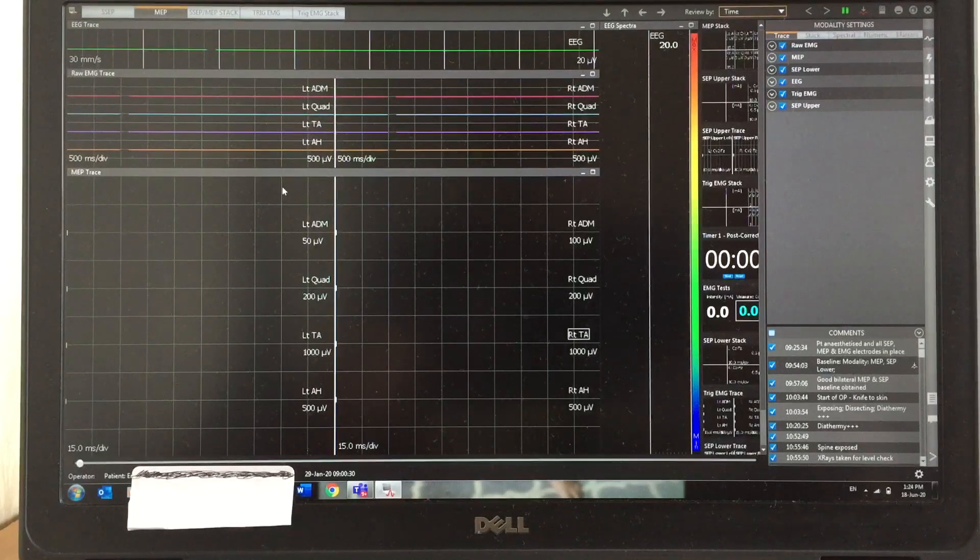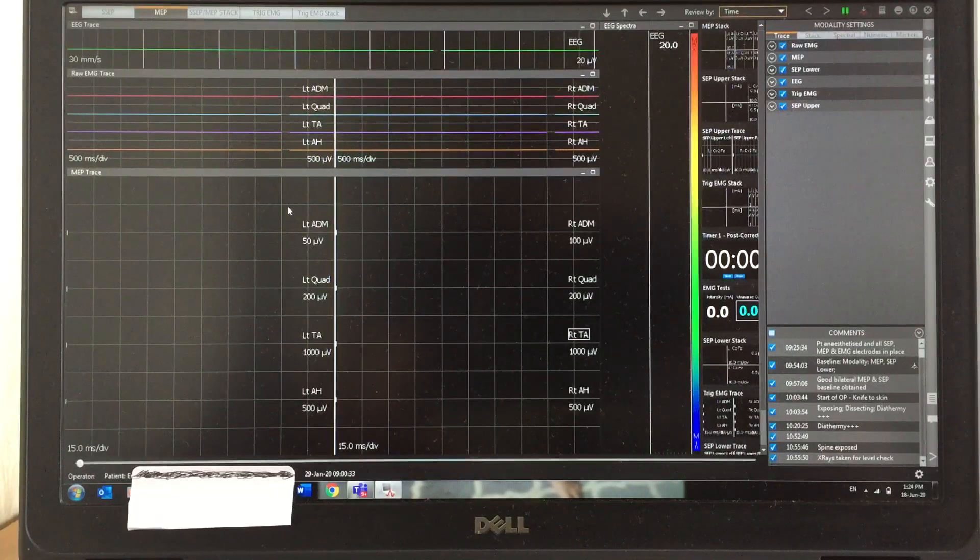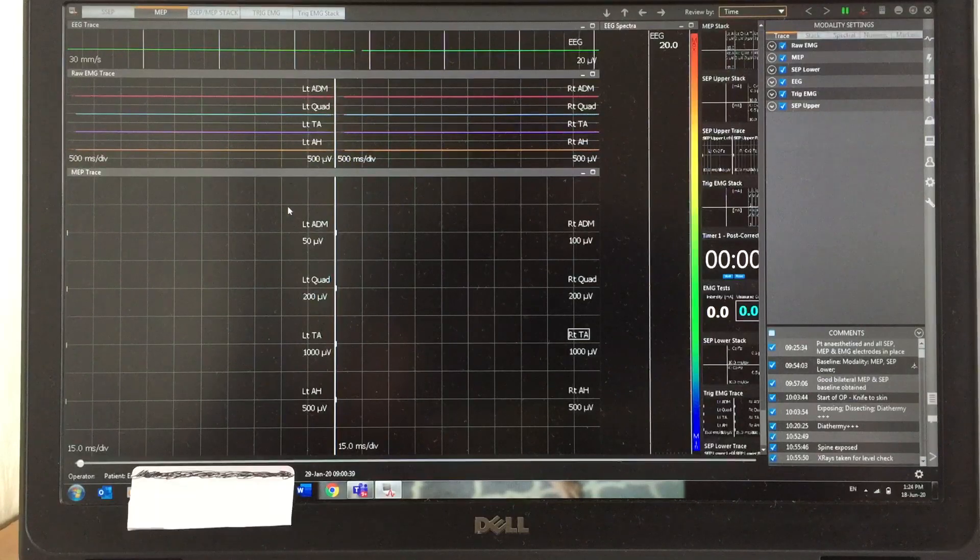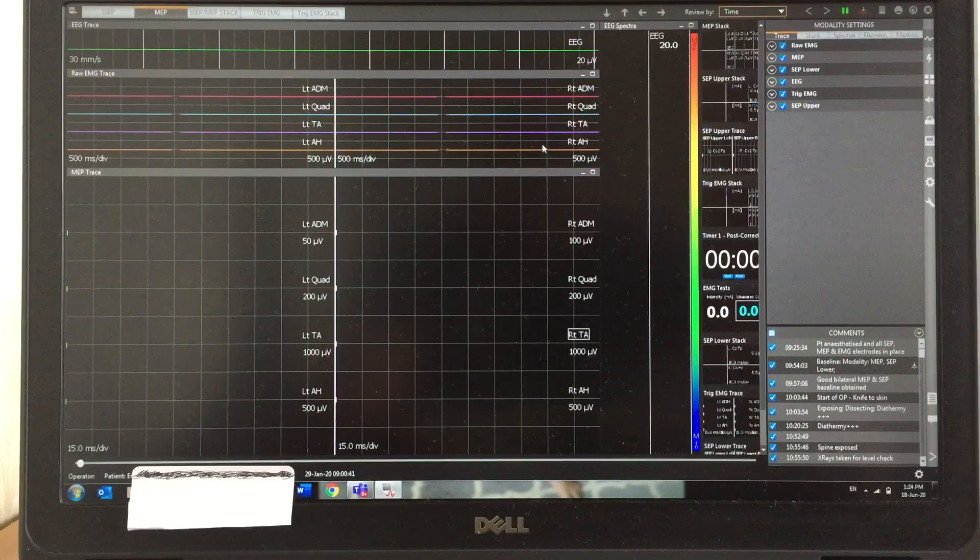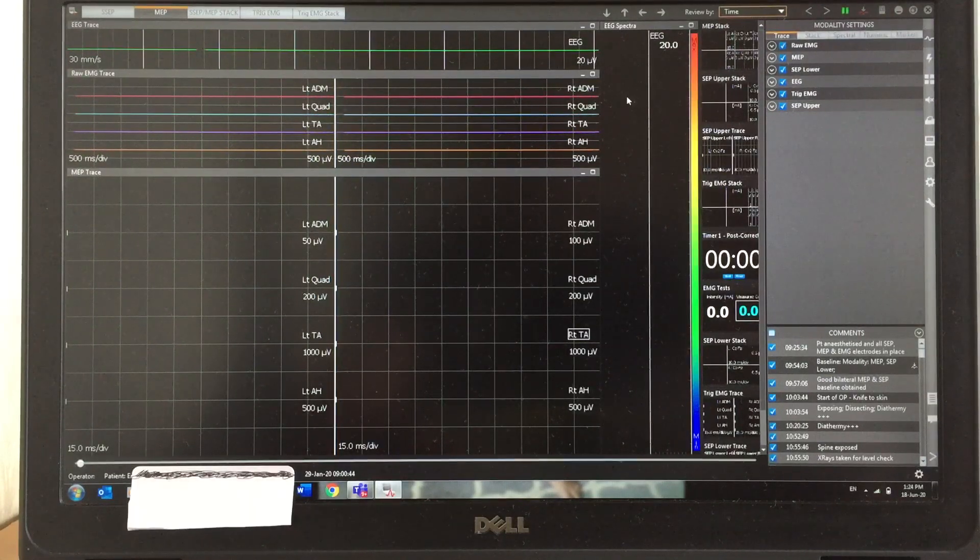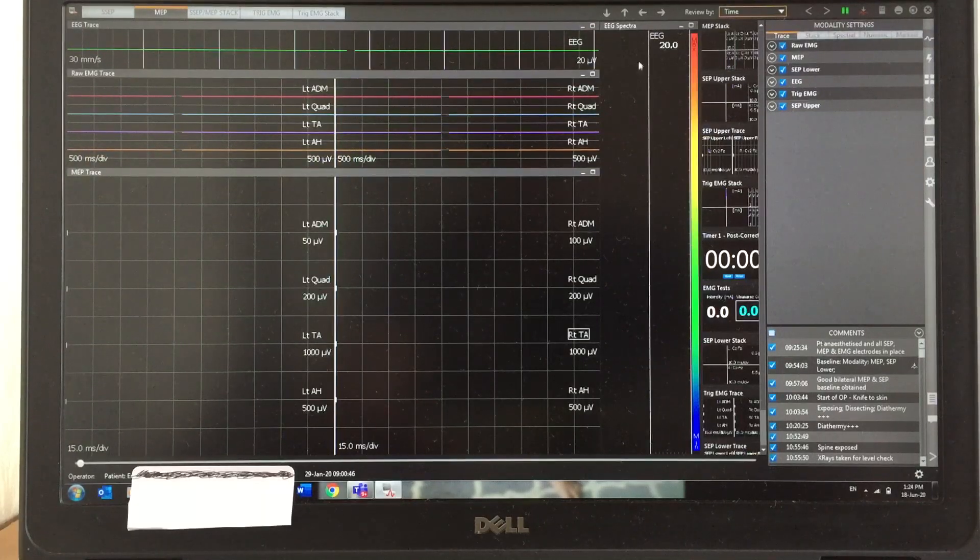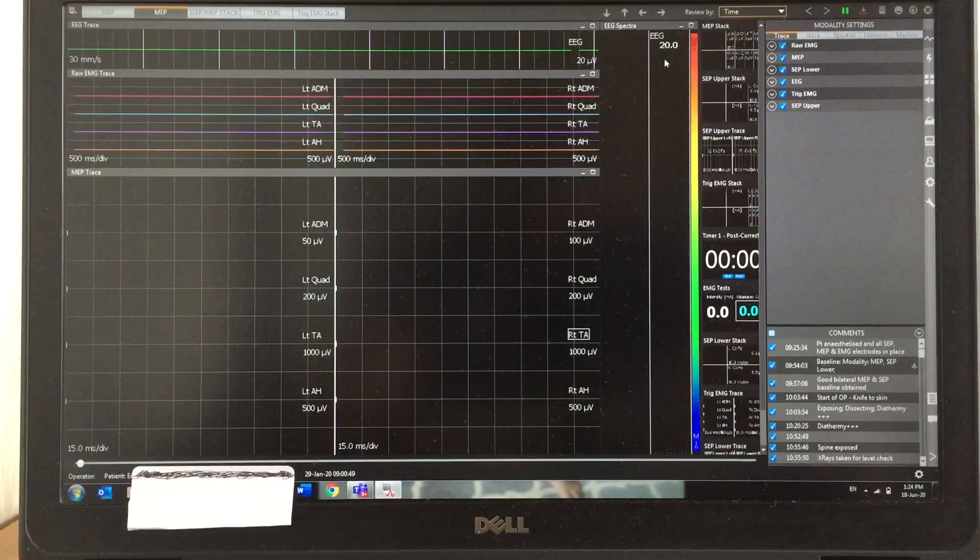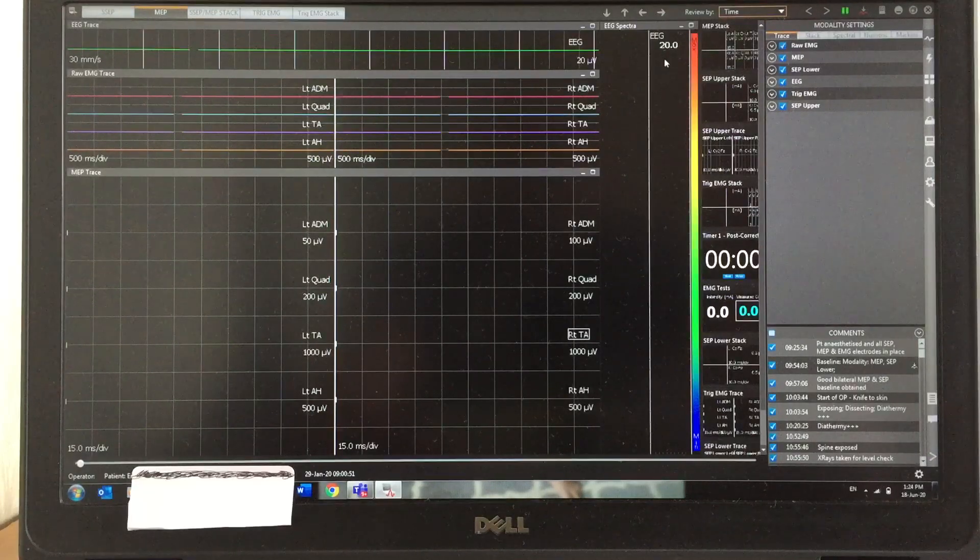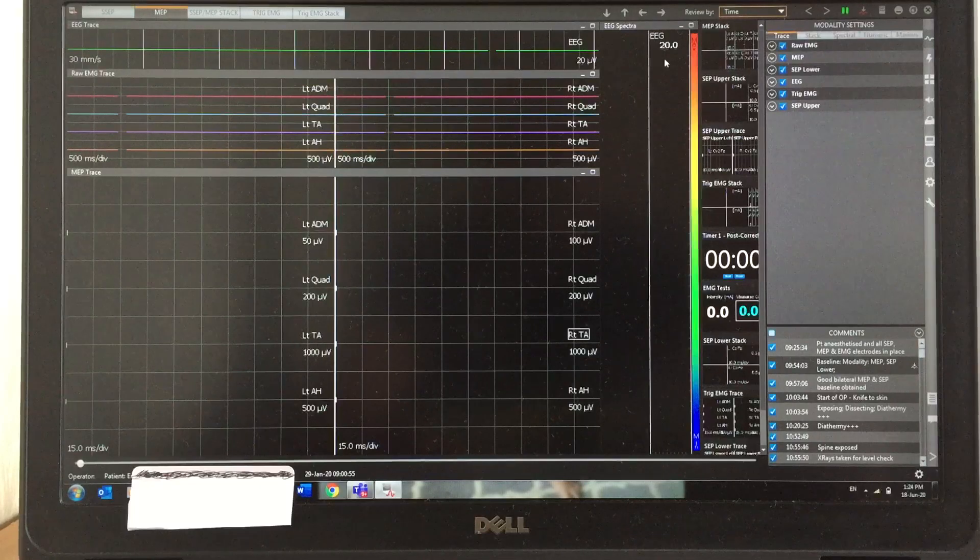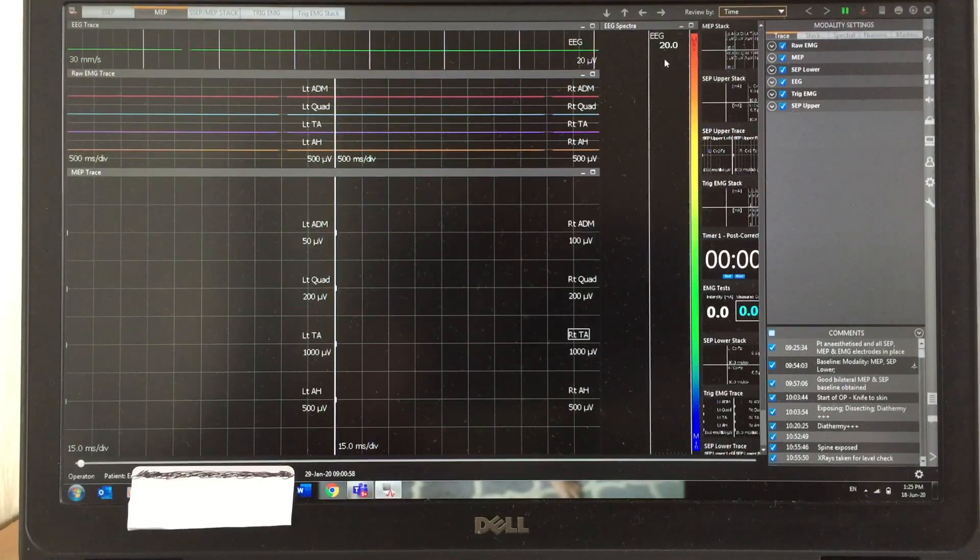This is the spectral EEG, which is useful to find out how deep the patient is anesthetized. This gives indirect information about the BIS monitoring. Still we have not recorded any EMG, EEG, or MEP information.